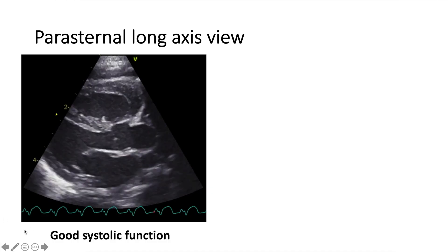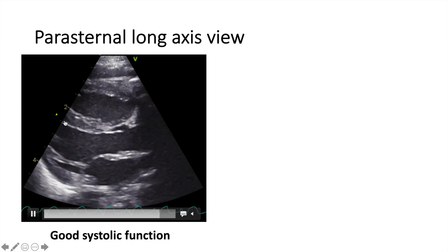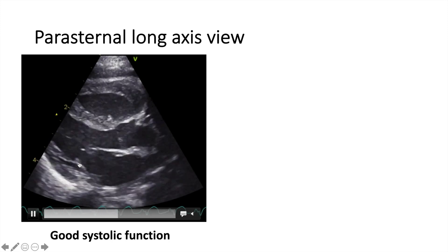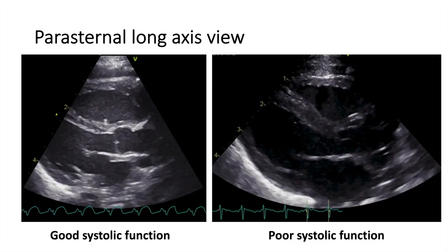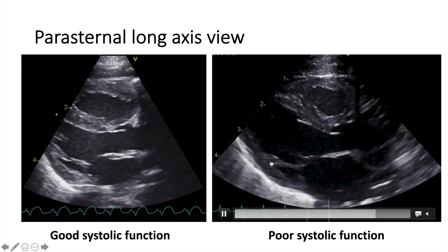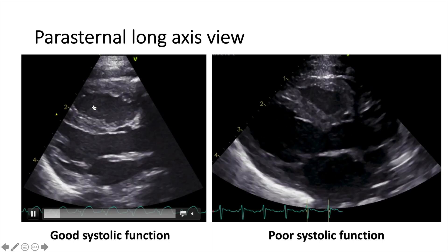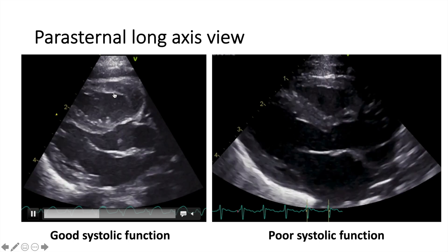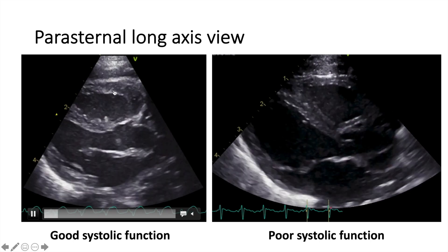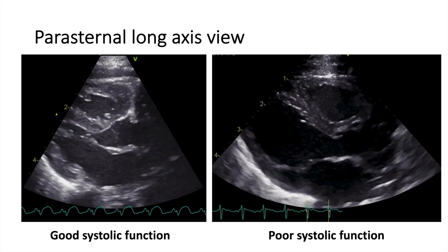What do we look at? We look at systolic function. You can see the two walls of the left ventricle — the posterior wall and the interventricular septum — getting closer to each other with systole, so there is good contractility. If you want to see poor contractility, the walls are barely moving — so that is poor systolic function. With experience, you will also be able to judge RV contractility. As the RV contracts, the free wall of the RV thickens, so this is good contractility as well. It's difficult to assess fully from this view.